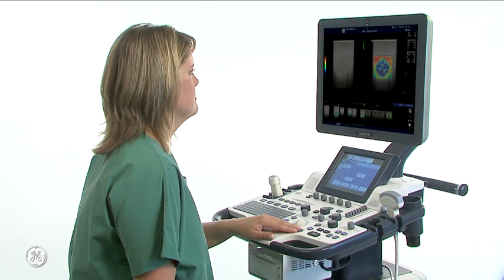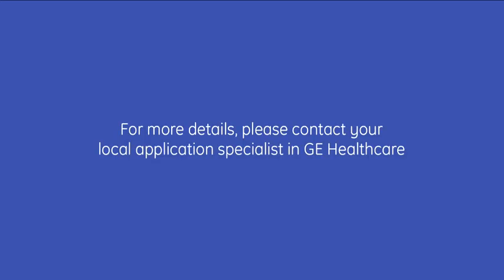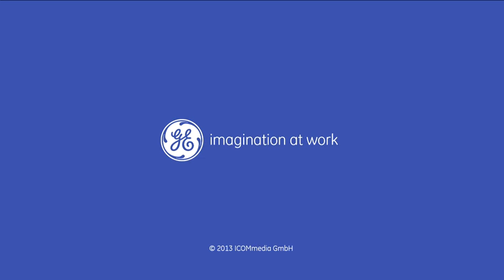This concludes our elastography instructional video for the Logic F-Series with touch panel. For more details, please contact your local application specialist at GE Healthcare. GE — Imagination at Work.